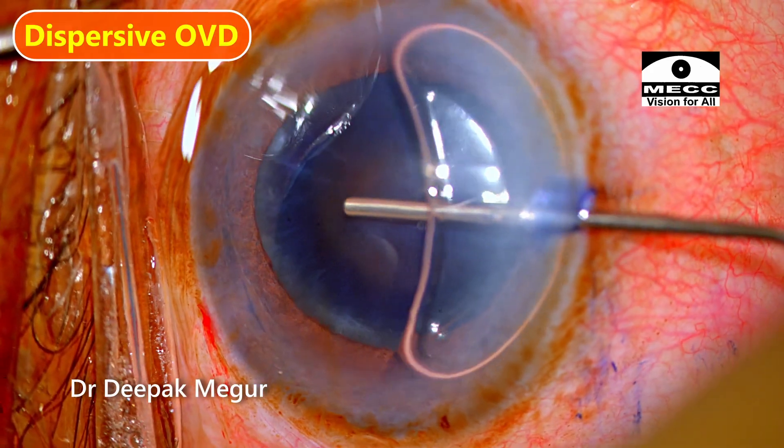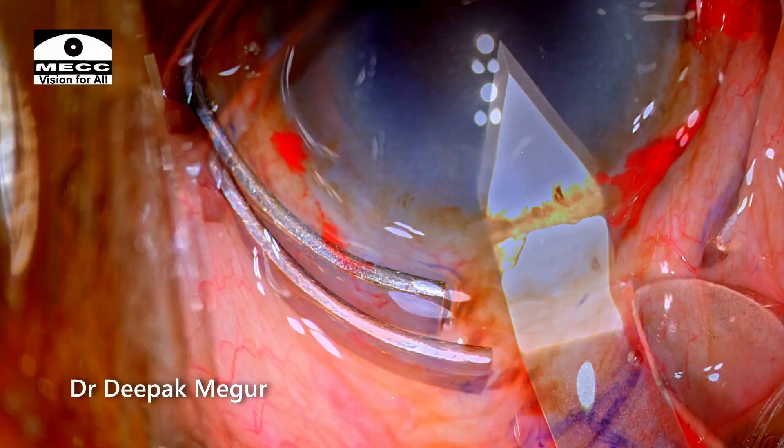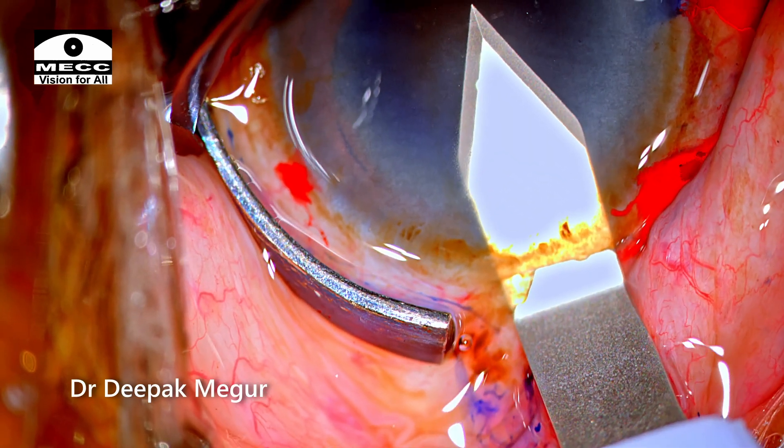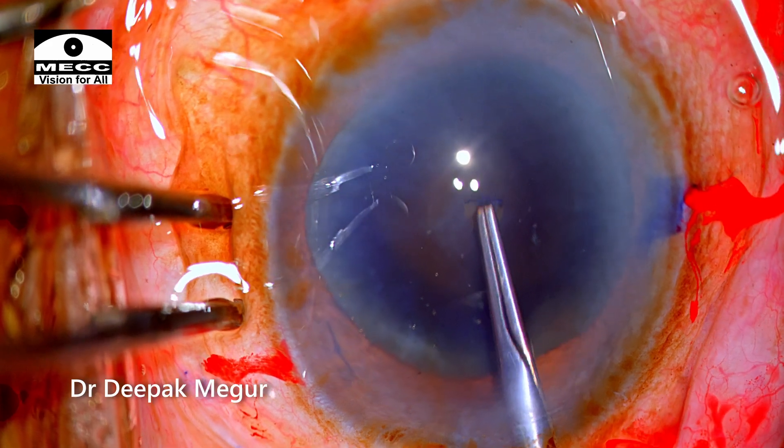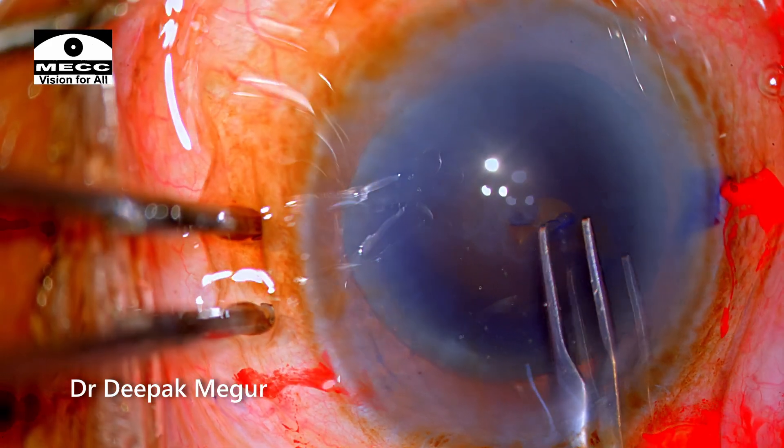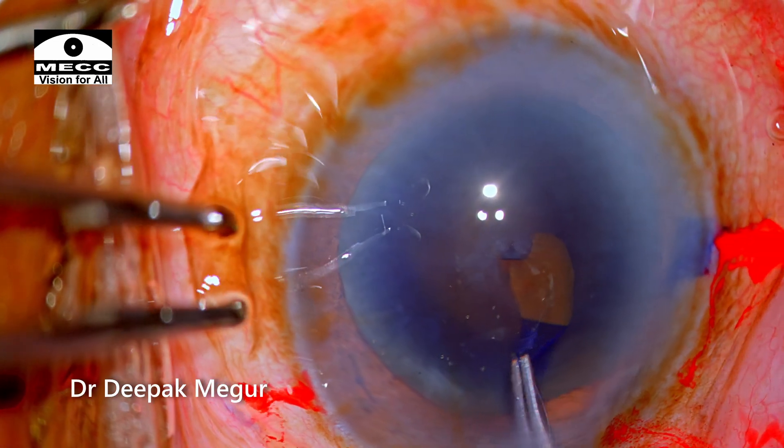Dispersive OVD is being injected into the anterior chamber, and a posterior limbal-based 2.8 mm incision is created. The rhexis is being done. Zonules are healthy — that's what I noticed first as I began my rhexis.